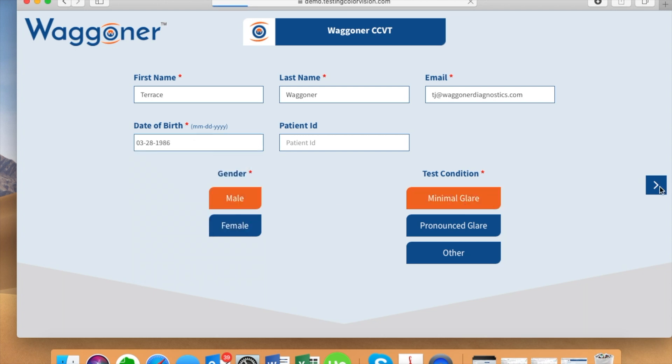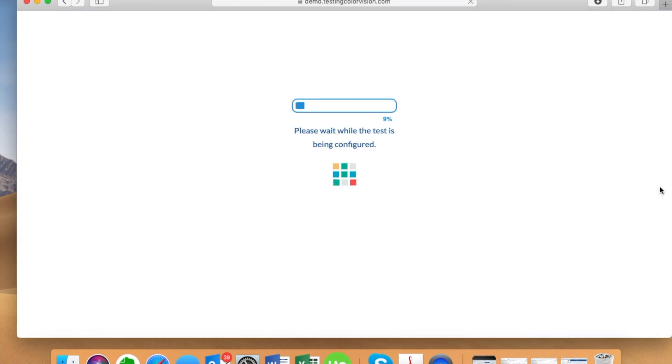At this point the test plates and test structure are loading. How long this takes will depend on the speed of your internet connection.